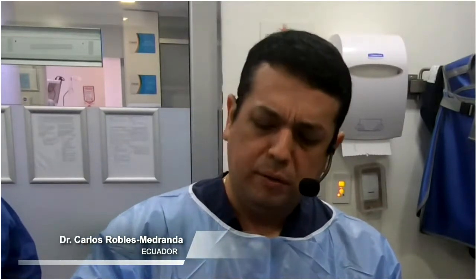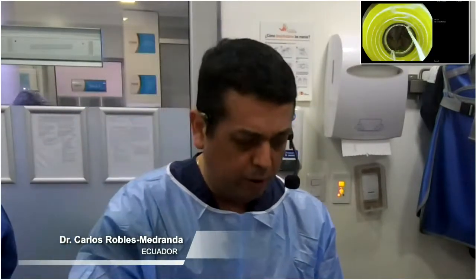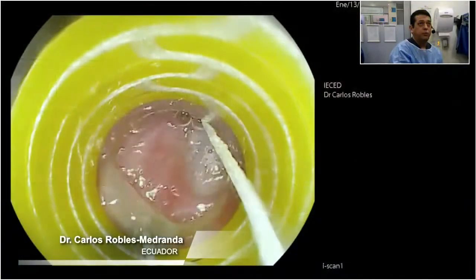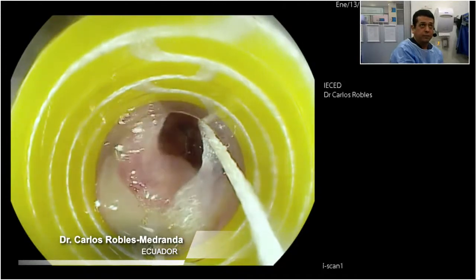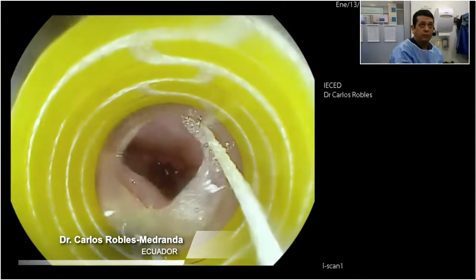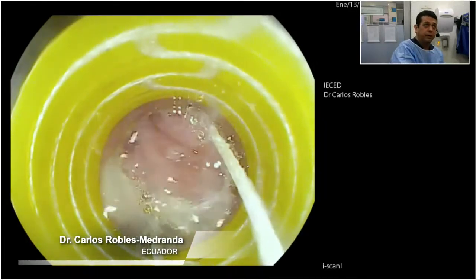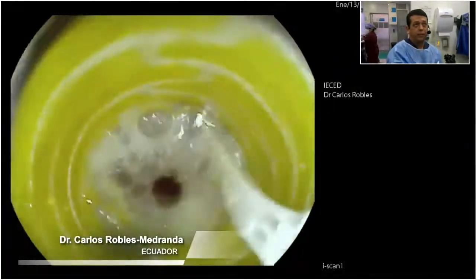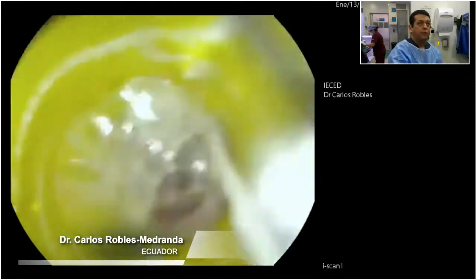So now we have already put the distal part of the band ligation. You can see the yellow rubbers, but this is very important. You see the central part. You don't need to see the black rubber, because if not, the position is not very good. It's not well placed, your band ligator. So now I am introducing one of the advantages of the difference between the other band ligation kits: the distal part, the cap, is smaller. So this is a good advantage. I believe it could have some potential in pediatric patients also, and we will see how it works now.